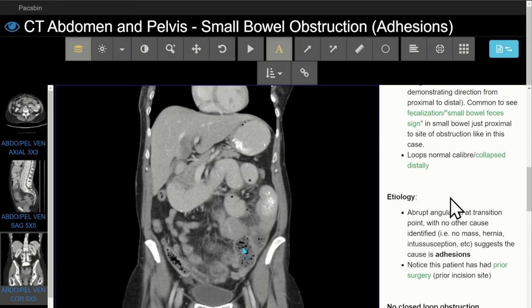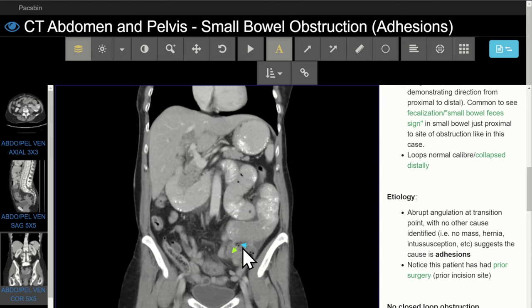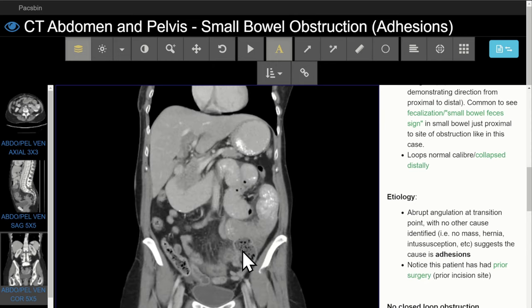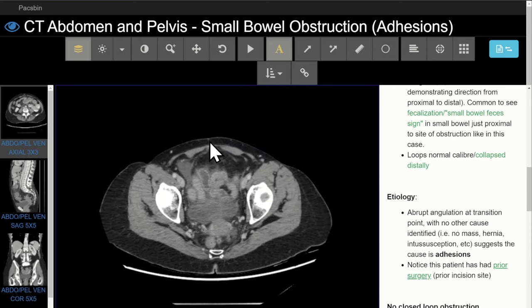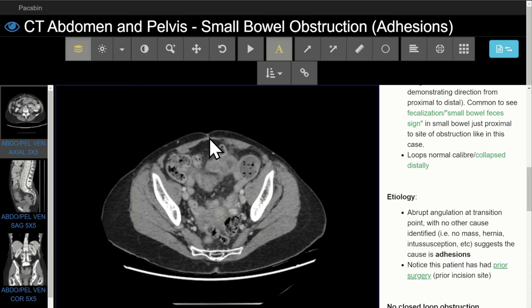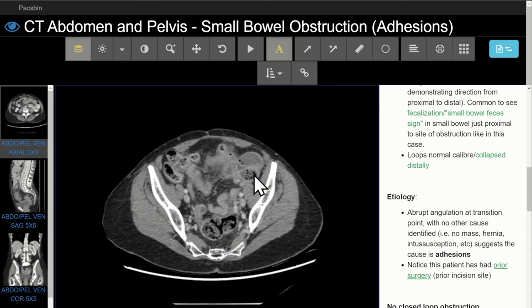So we've determined that there's a small bowel obstruction. Step two is determining the etiology or cause. We notice there's an abrupt angulation of bowel at the site of the transition, and there's no mass, hernia, intussusception, or other obvious cause on CT. We also notice that this patient has had some sort of previous procedure — here we see an incision site in the anterior abdominal wall. So the cause here is most likely adhesions — bands of scar tissue present in patients with prior surgery, and the most common cause of small bowel obstruction.